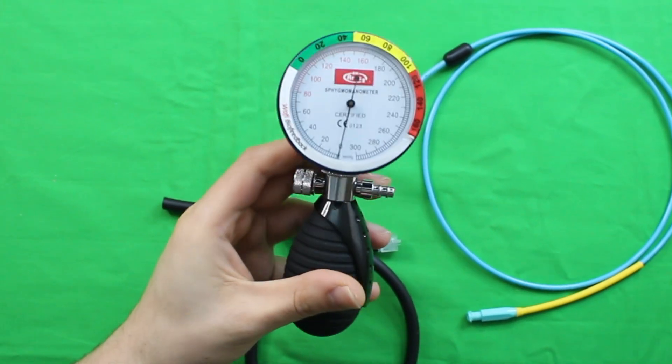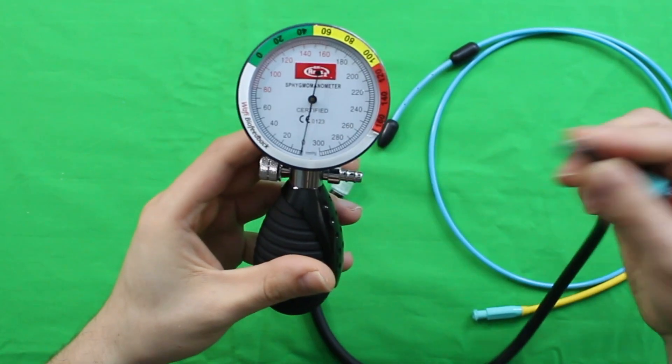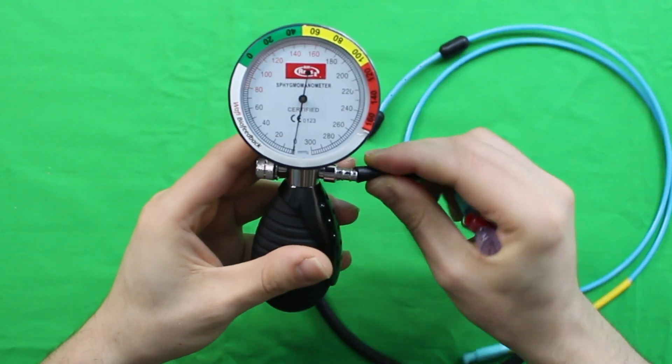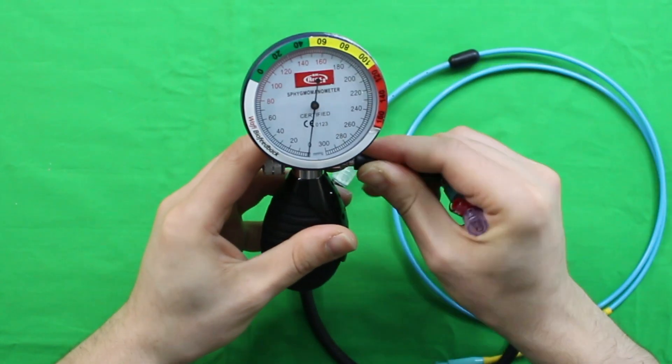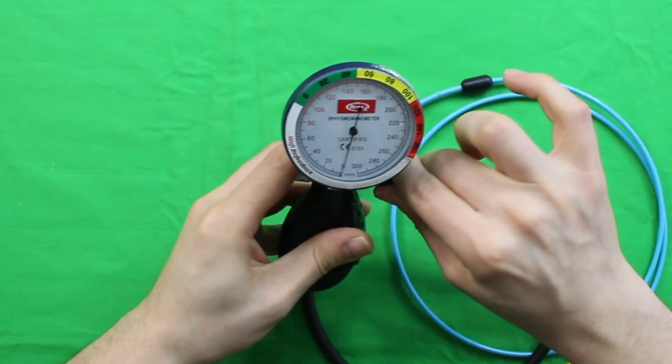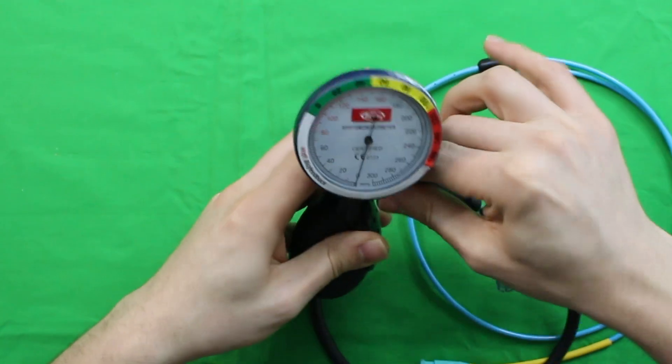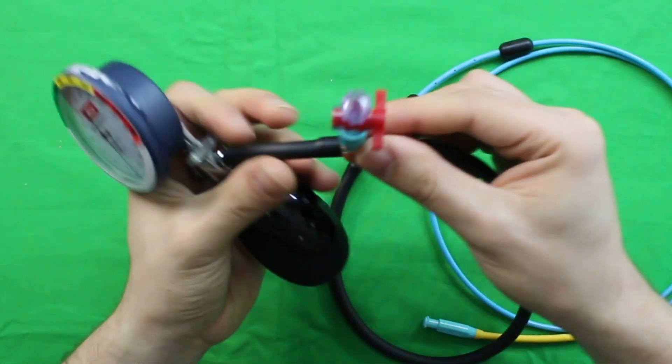Attach the pressure valve to the manometer and turn the valve on.